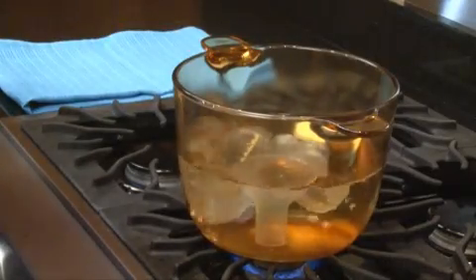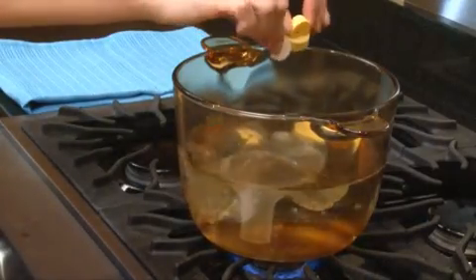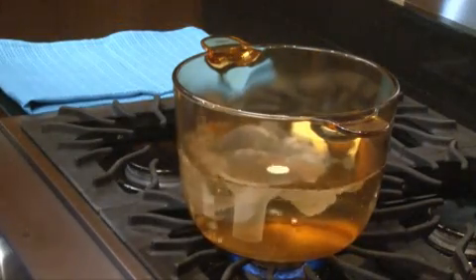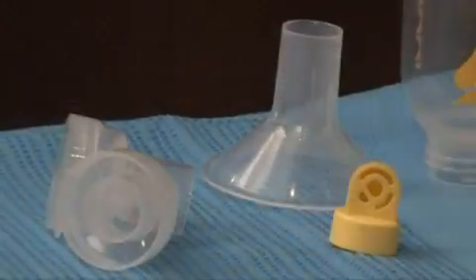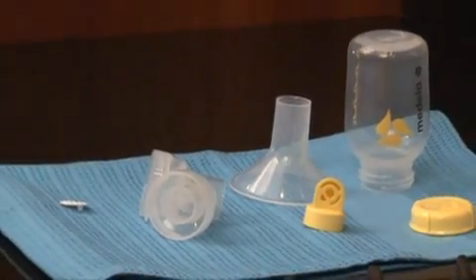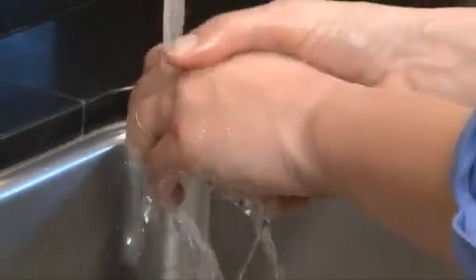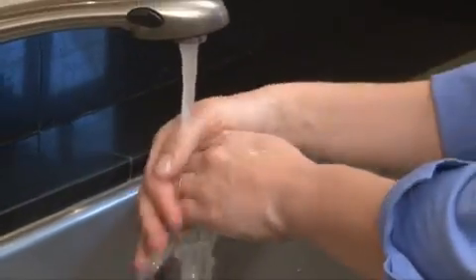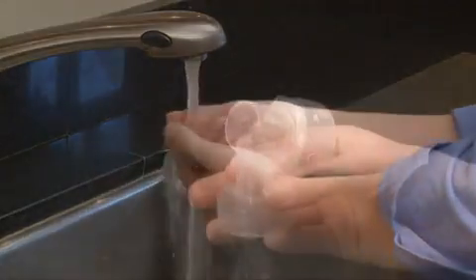Sanitize the parts in boiling water for 10 minutes. Refer to the cleaning and care section in your breast pump instructions for use for detailed information. Before assembling your Pump in Style Advanced, be sure that all parts air dry after cleaning. Wash your hands before touching breasts or containers and avoid touching the inside of containers or lids.